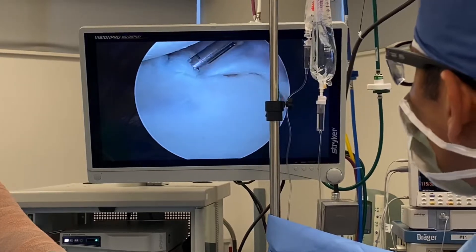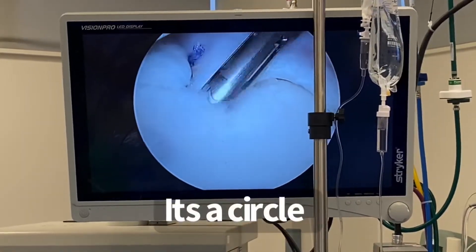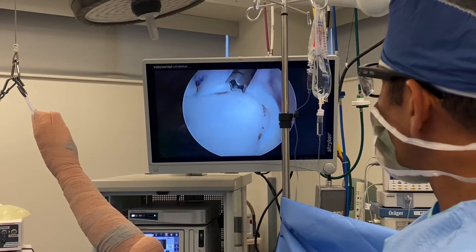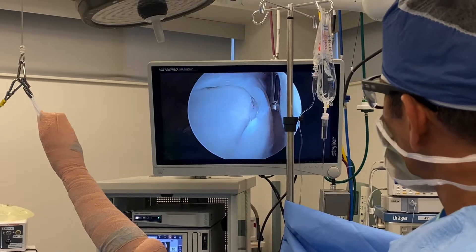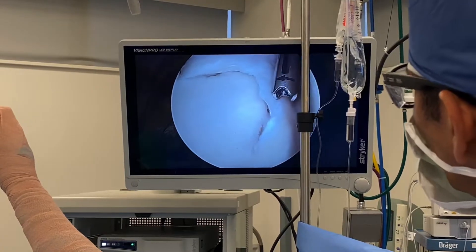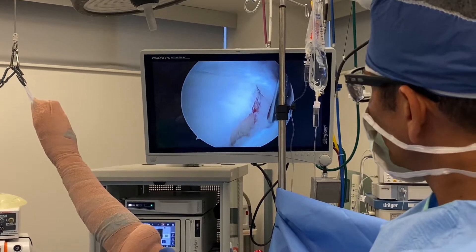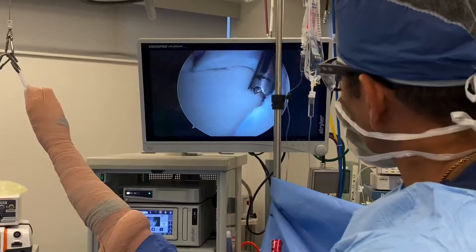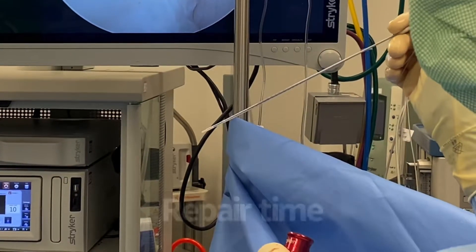You can see the front of the o-ring, the top of the o-ring, and the back of the o-ring — that's usually described as superior, anterior, and posterior labrum. So now we're working on the superior labrum. We're going to reattach this labrum onto this bone here that I've already prepared. You can see the nice rough surface right there with some bleeding.